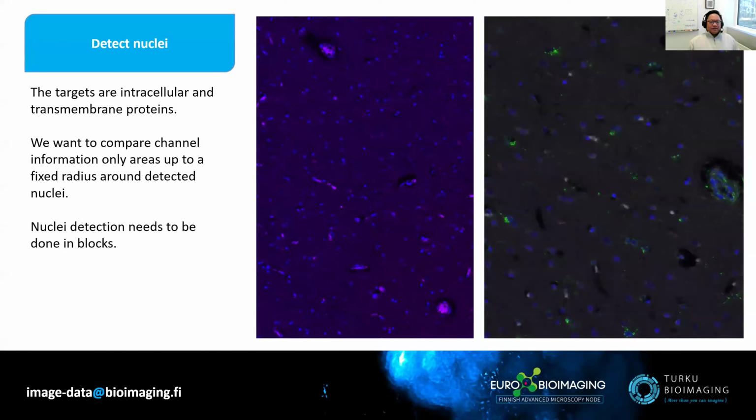Then, because the targets of this study are intracellular and transmembrane proteins, first we wanted to compare the channel information only in areas that are within a fixed radius of nuclei. So that meant that we had to detect all the nuclei in the entire whole slide image.